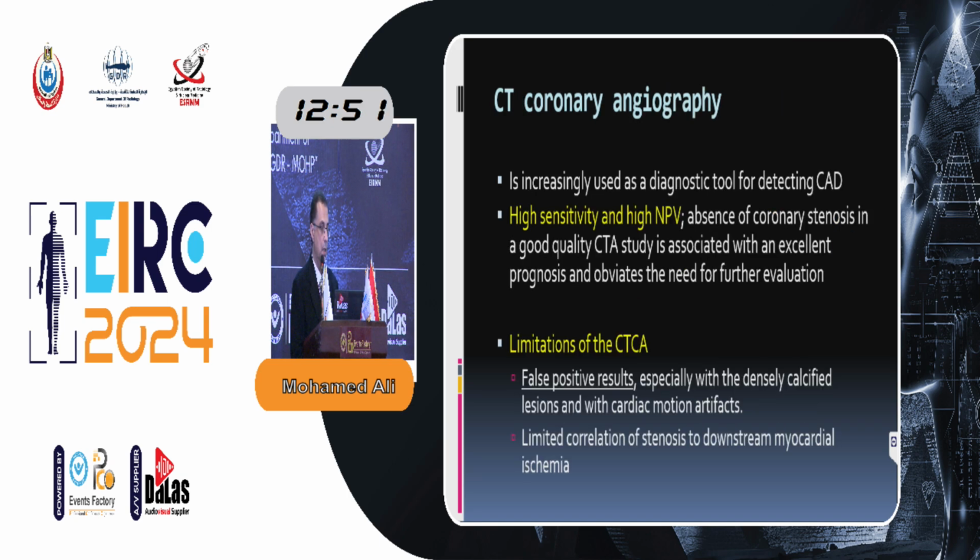On the other hand, CT coronary angiography is increasingly used as a diagnostic tool for detecting coronary artery disease. It has a high sensitivity and high negative predictive value. This means the absence of coronary stenosis in a good quality CT angiography study is associated with excellent prognosis and obviates the need for further evaluation.